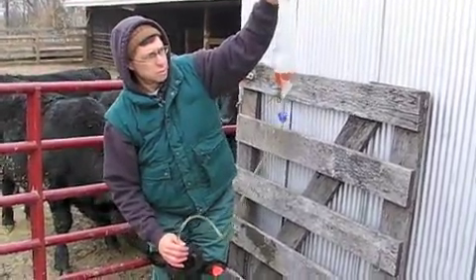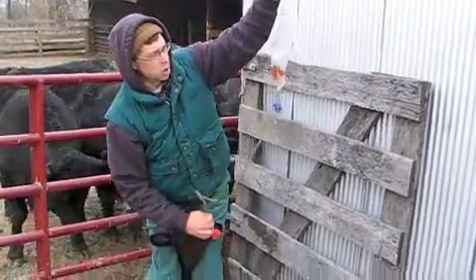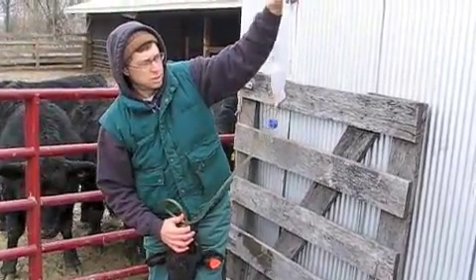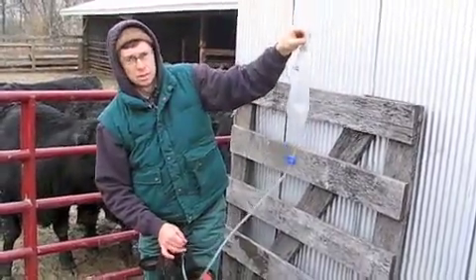The calf's starting to struggle just a little bit — his tummy's getting full as well. That's okay, don't worry about it. No matter what, don't pull the tube out. If he starts struggling and you think you're going to pull the tube out, make sure you crimp it first. That's all there is to it.